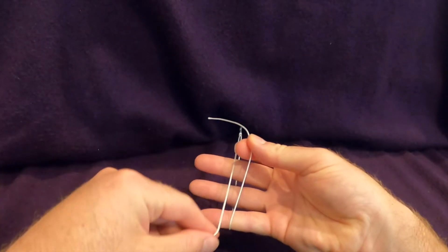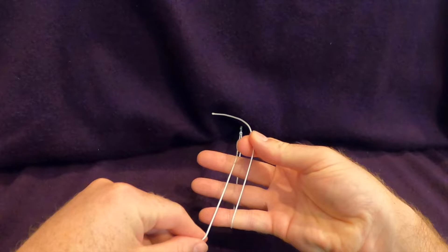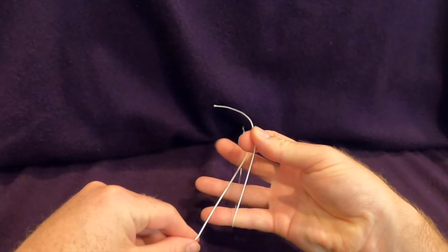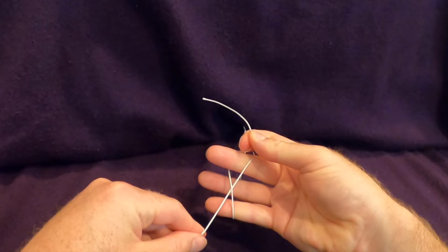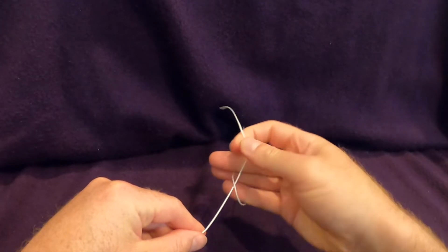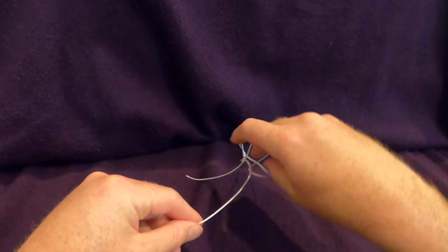Let's watch in slow motion. Right here, both tails are pointing in opposite directions. The middle finger loops the suture and now the sutures are on either side of the middle finger. As the hand rotates, the suture transitions from the fingernail side to the fingertip side and gets pulled through the loop.